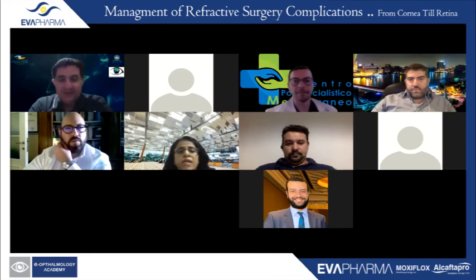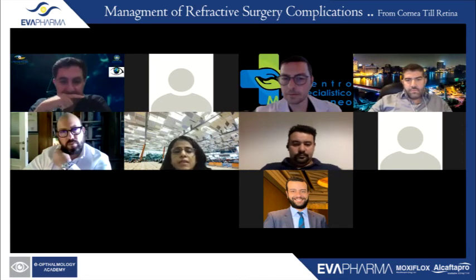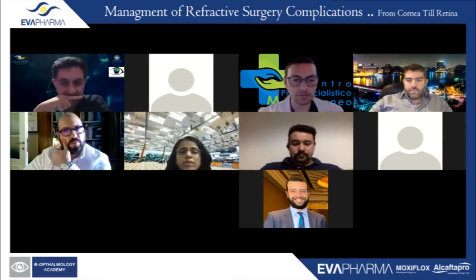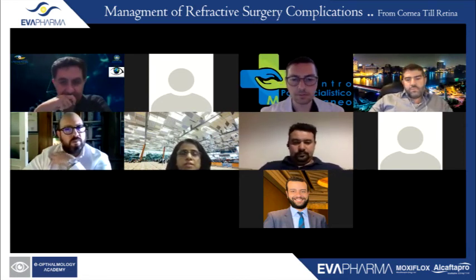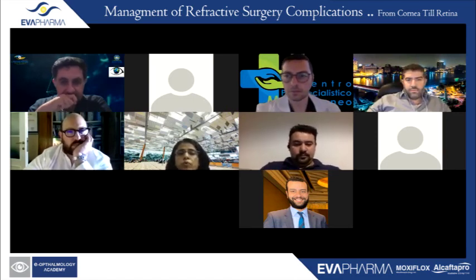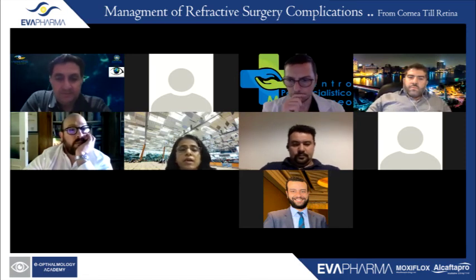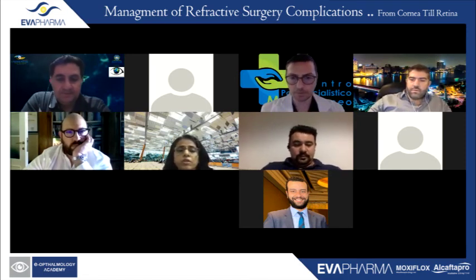Yeah, I think basically like every surgery, Ashraf, SMILE also does have its complications, but it is really not a difficult surgery as long as you have your concepts right. Many of the videos which I showed were by training surgeons, and many of them you could see were also easily handled, and patients do well. The epithelial implantation may be a little tougher to handle. You would probably still want to do a circle cut and then handle that, but first observe to see whether it's growing or static. If it's static and not growing, you could just leave it alone.